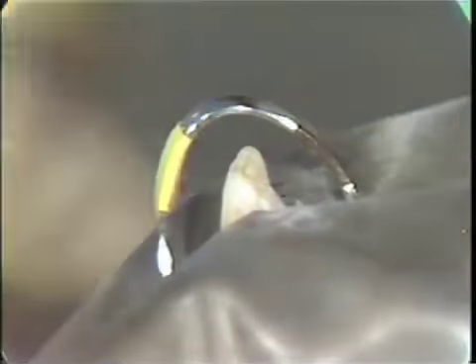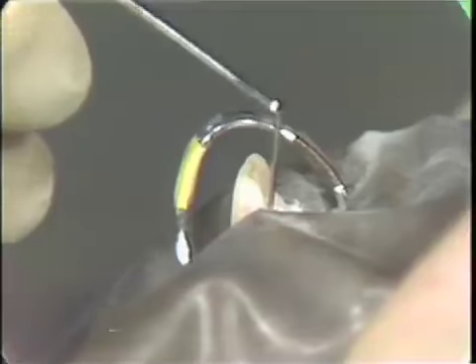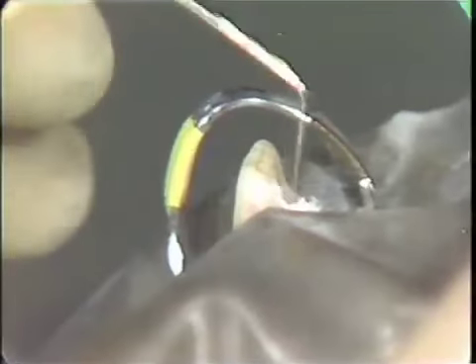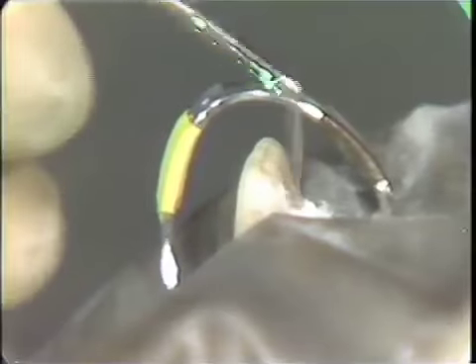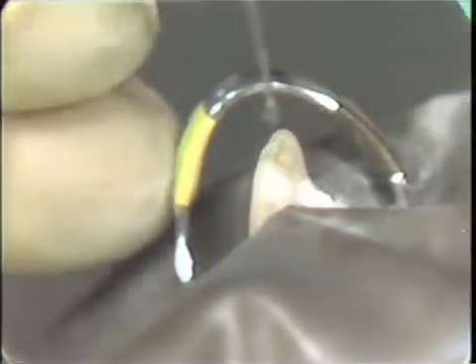When you're finished with that, then we just have to check the preparation, making sure that it's accurate and adequate and conforms to all of the requirements that we had for an adequate preparation. Then use your endodontic spoon excavator to completely clean all of the debris from your pulp chamber.